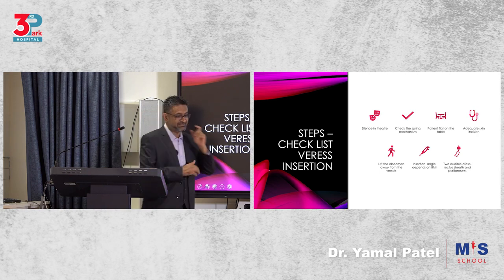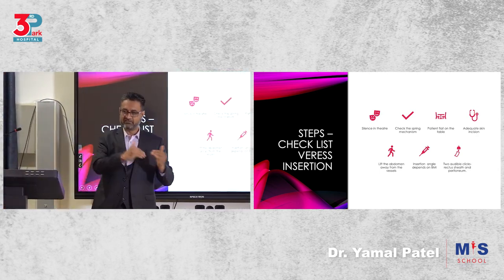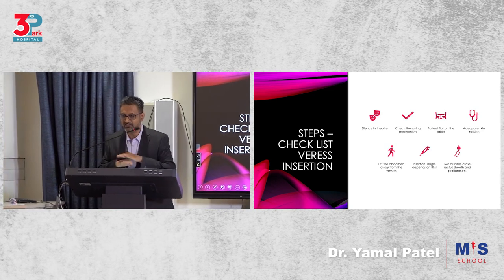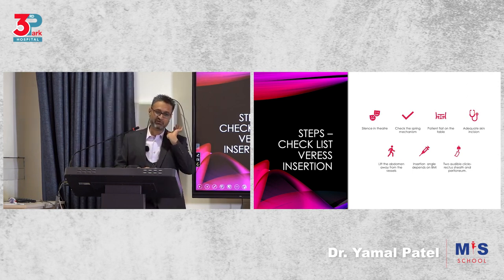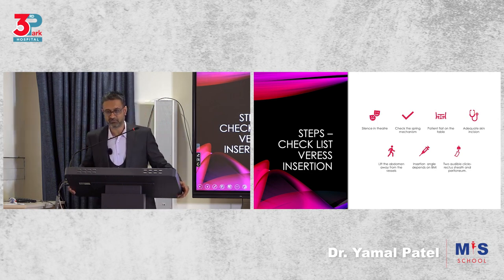The patient should always be flat. Do not try and enter when the patient is already in Trendelenburg. Your direction will take you towards the aorta, or the vena cava, in that position. So the patient has to be flat. Initial entry, patient flat. These are rules, ideally not to be broken. With experience, what you do is up to you, but for initial beginners, these are rules not to be broken.